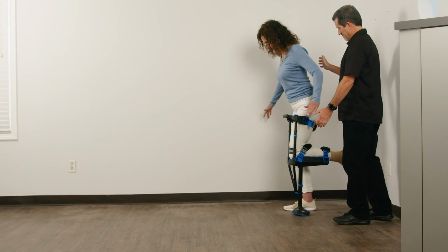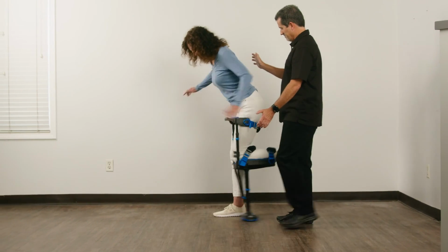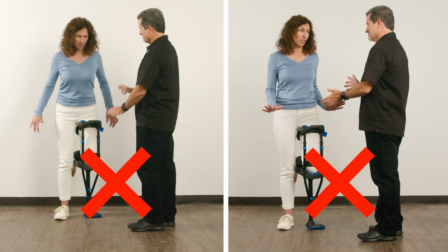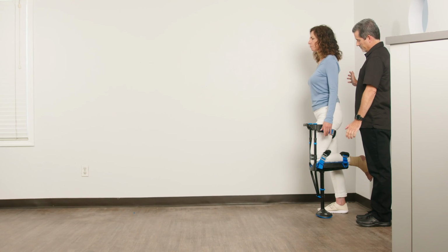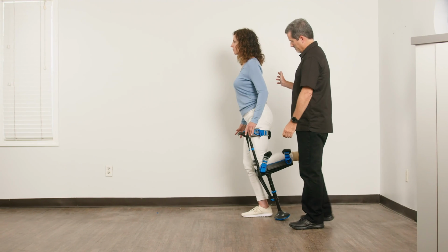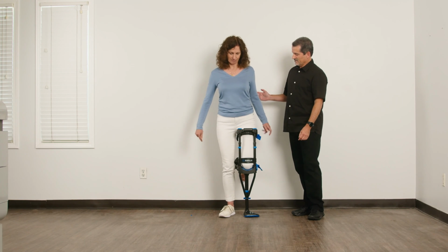Patients who pass the physical qualifications for use might still struggle to adapt due to psychological factors. If the patient exhibits extreme fear, is overly nervous, or unmotivated to use the iWALK, then adaptation is unlikely. Also, Type A personalities have a tendency to overthink the process, which can inhibit their body's ability to naturally adapt. The way to handle this type of patient is to distract them during the training process.